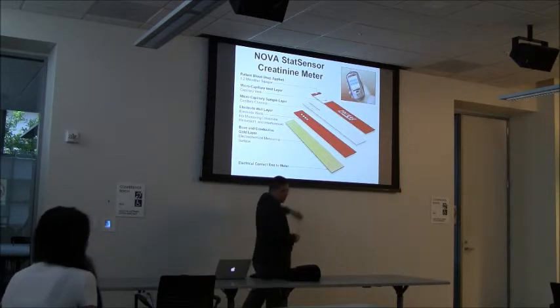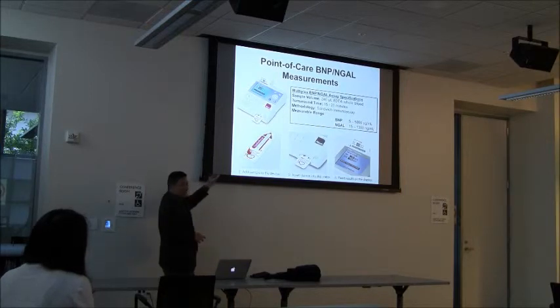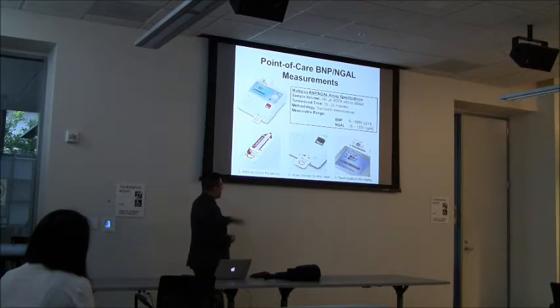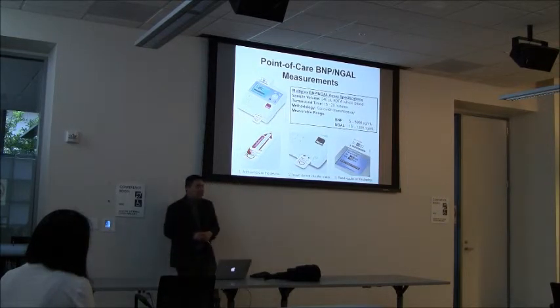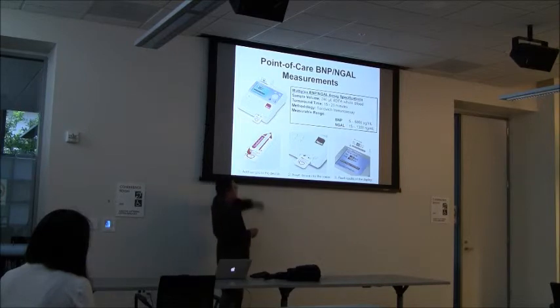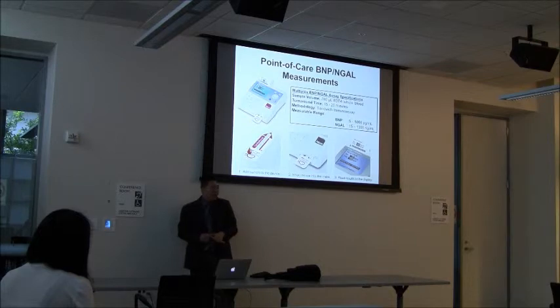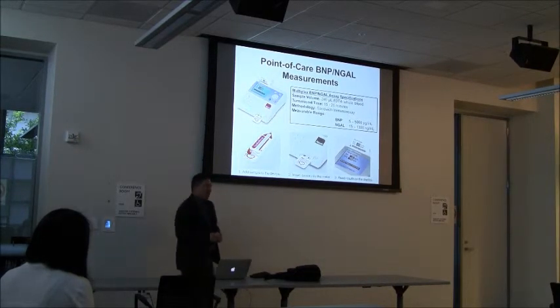The other sensor, this guy's about $30 to $60 per card. Starts going up. These enzyme-based immunoassays, they get a little bit more expensive. They can get quite pricey. BNP, we actually run it in the hospital lab. It's actually the most expensive test we run for this side of clinical chemistry. There are more expensive tests out there, though. Genetic testing being one of them can be as expensive as $15,000 if you do sequencing per patient.